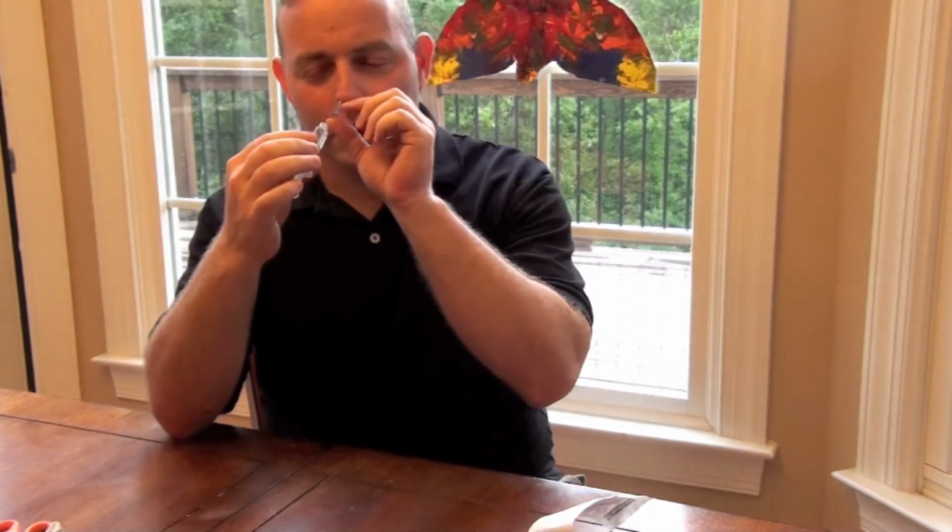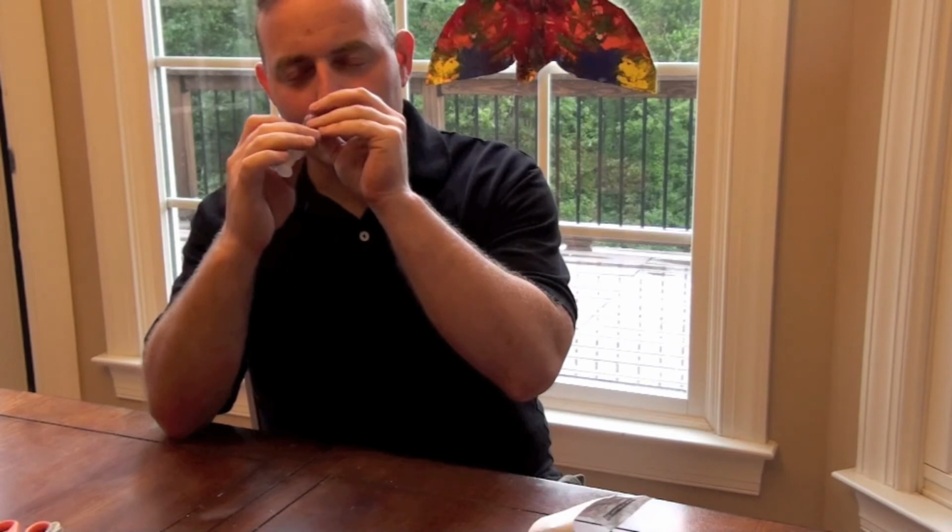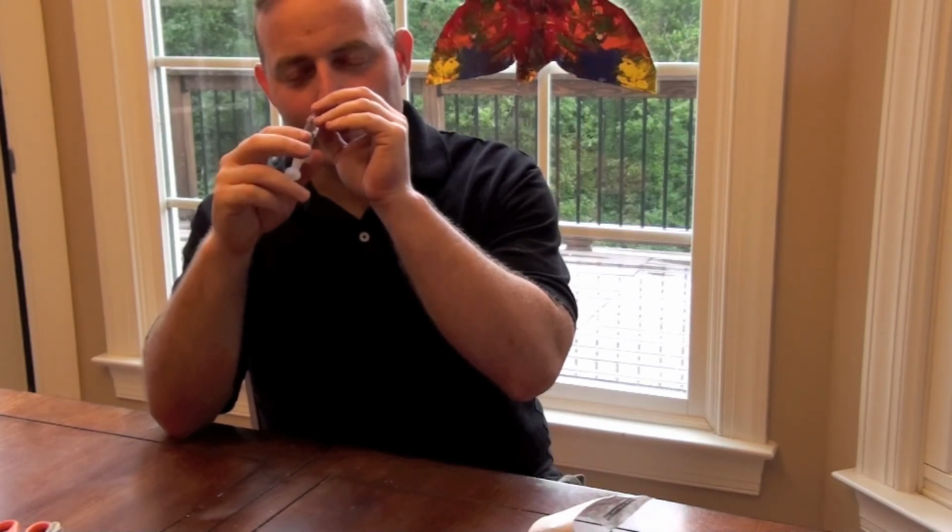And you'll be surprised how far it is to the back of the throat. And there we go. That is pretty far in, isn't it? And you can feel it when you swallow. The hard part is visual spatial relations. When affixing the syringe to yourself, I would suggest having a family member do that. And now gently inject 2 cc's.